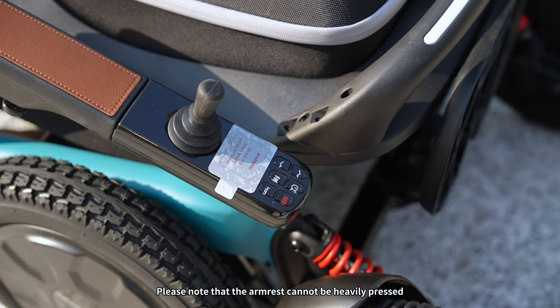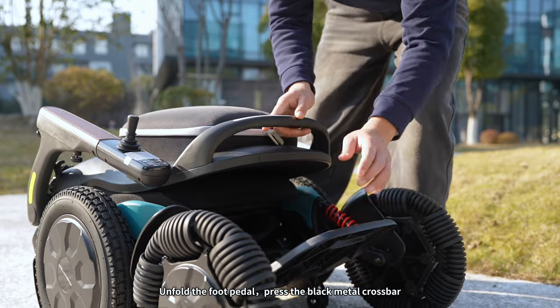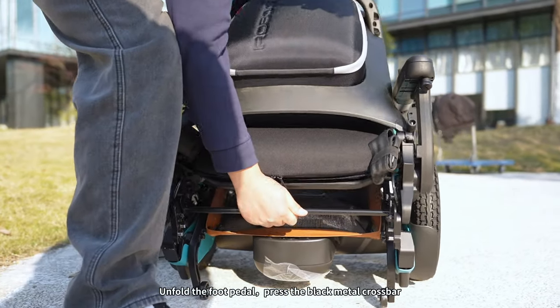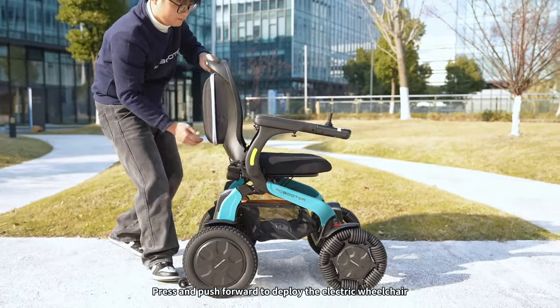Please note that the armrest cannot be heavily pressed. Unfold the foot pedal and press the black metal crossbar, pressing and pushing forward to deploy the electric wheelchair.